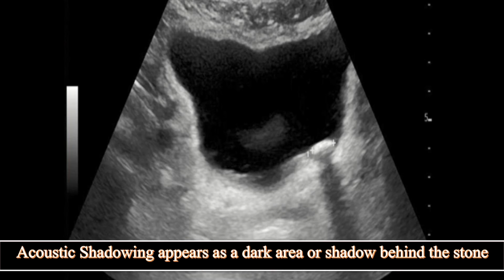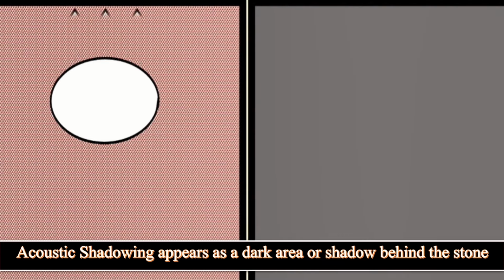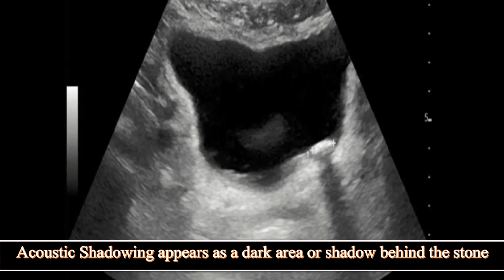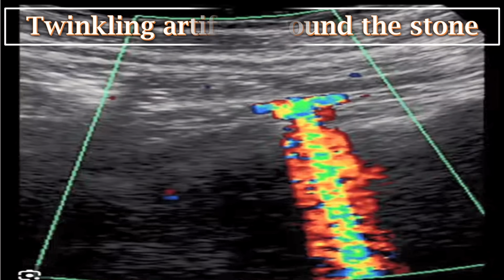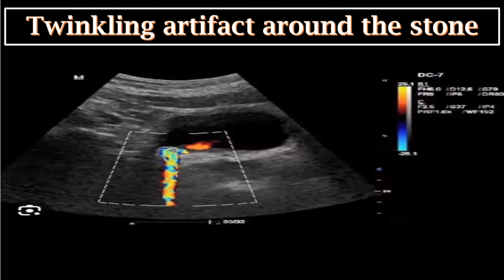Acoustic shadowing appears as a dark area or shadow behind the stone, caused by the stone's ability to block or attenuate the ultrasound waves. This shadowing is a key characteristic that helps to differentiate kidney stones from other structures in the kidney. Color Doppler can show a twinkling artifact around the stone, another helpful sign.